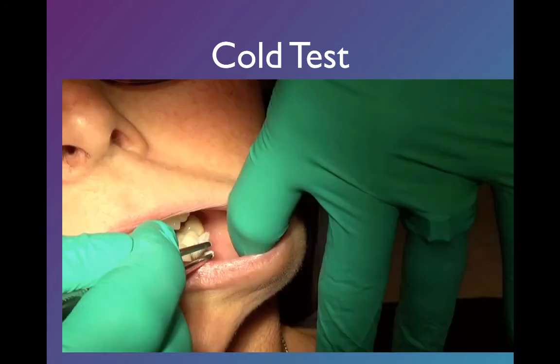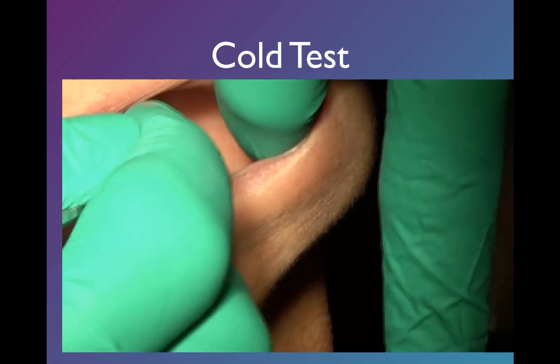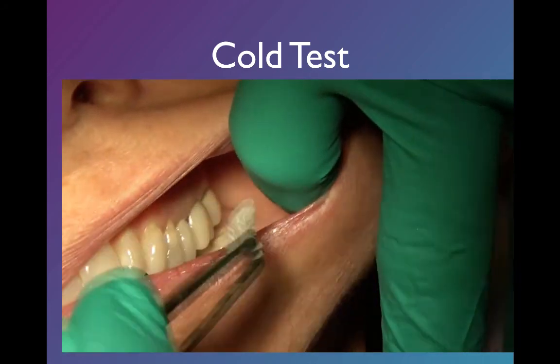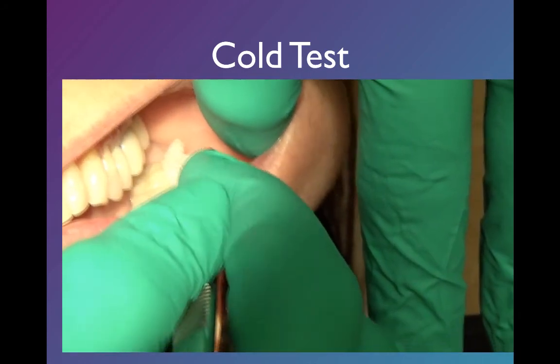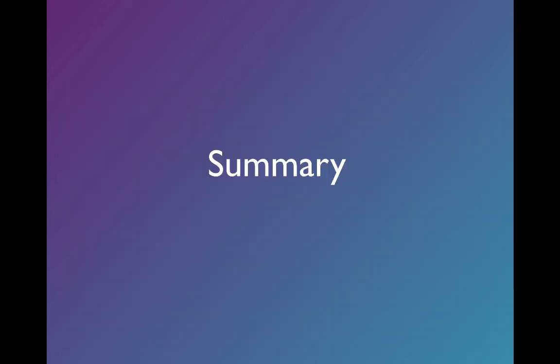So this is what it looks like clinically. Most of the time we're applying it to the buccal surface. And you can see it's nice and cold there. There you go. And we're having the patient either raise their hand or let us know. And these are responding a little quicker than most. Usually it takes about 5 seconds to do. And I always start on teeth I least suspect and then work back to the one that we most suspect.